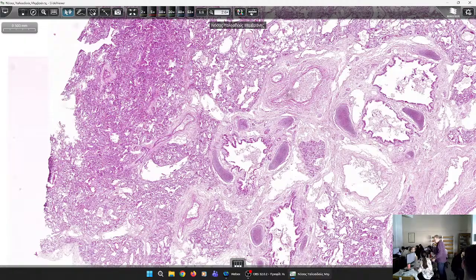It wasn't done this year, and so if it wasn't done, anything you see from my slides then. Yeah, please? Is the acute phase of ARDS in children and in general in adults, if you have the case of... You have the hyaline membranes. Yeah, but I'm not sure, but I remember that someone told us we have an exudative phase, right? It is some sort of exudate, but there are no inflammatory cells. Mainly it is destruction of the walls. It is not characterized by a transudate or an exudate. A transudate is common in pulmonary edema.